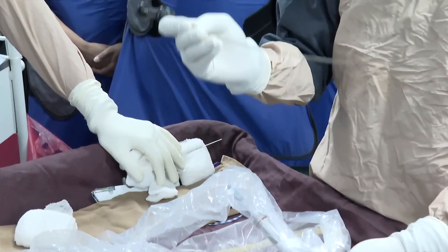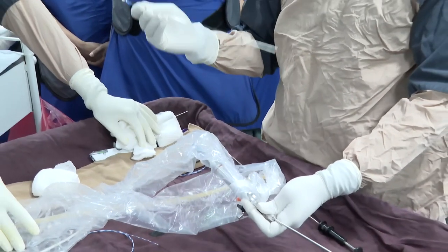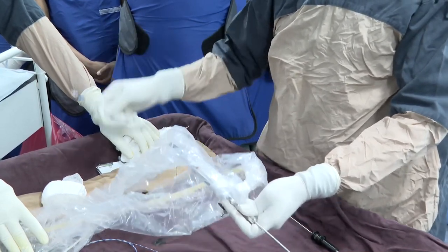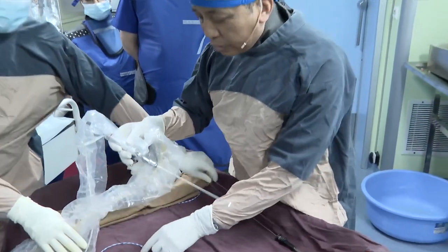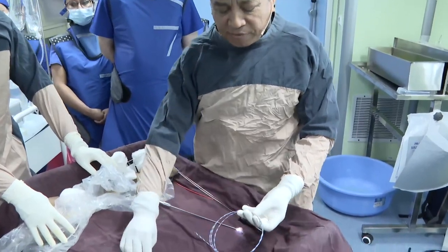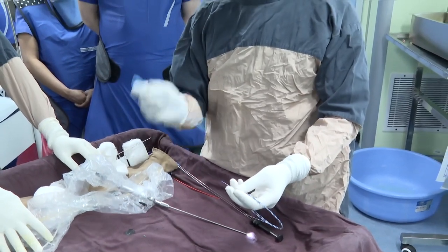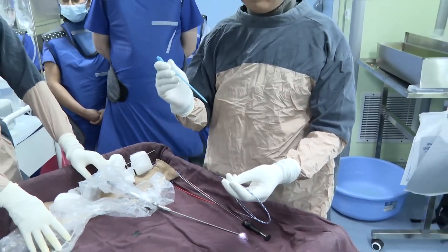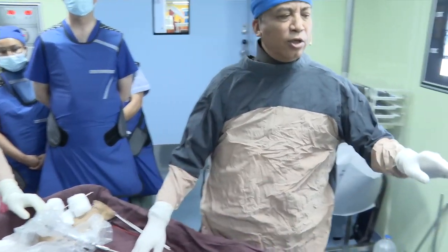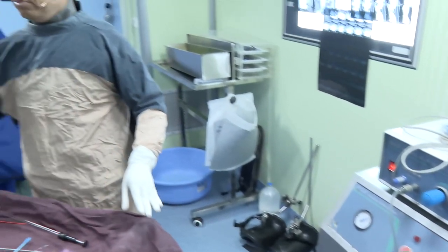The 1.4 mm lithoclast can break all kinds of hard stones. I prepare one to four graspers of six French if needed; otherwise we fragment the stone with the pneumatic lithoclast and stone evacuation is done by irrigation. I prefer to use a zebra guidewire because these fascial dilators glide very easily over it, but it's slippery so the assistant should be very careful.